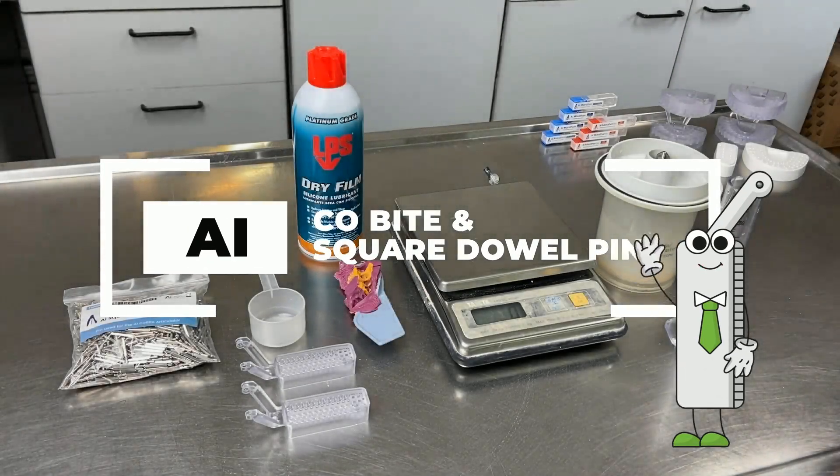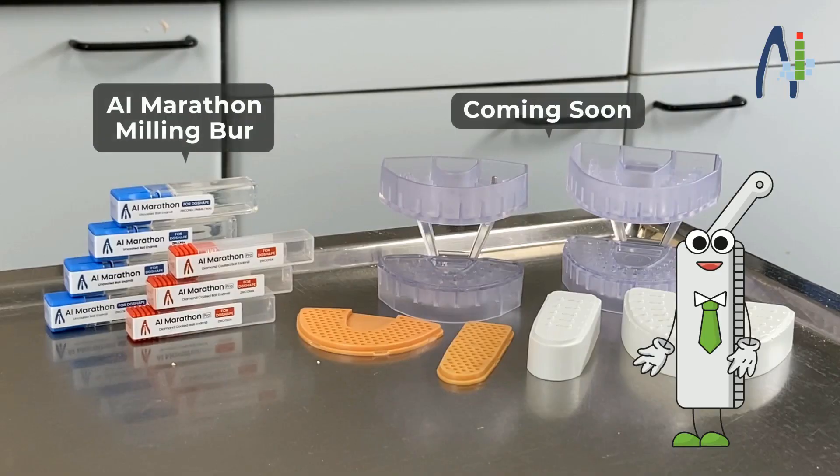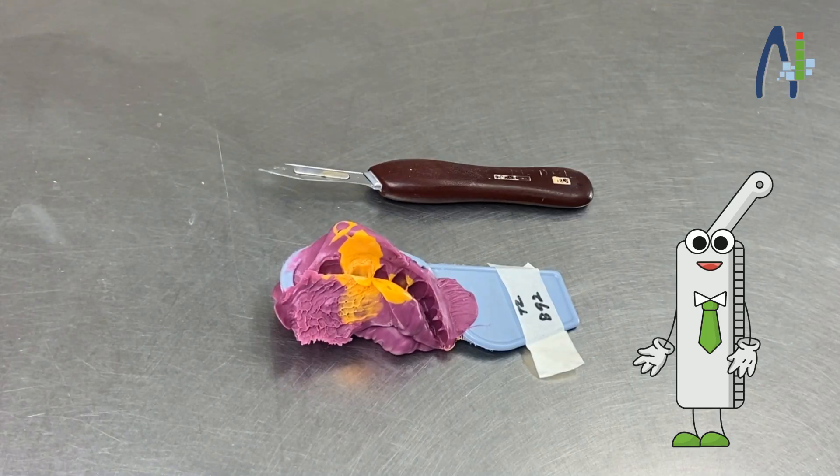Hello! Nice to meet you. I am AI CO Bite and I have a big family. We would all like to make your work a little bit easier. I will tell you why you may need me in model fabrication.